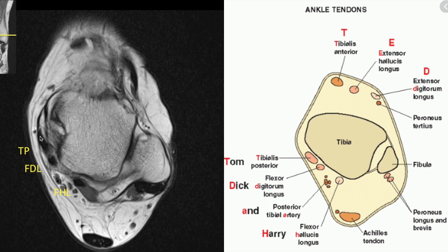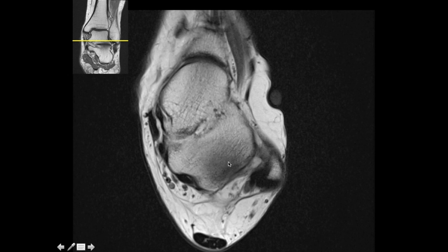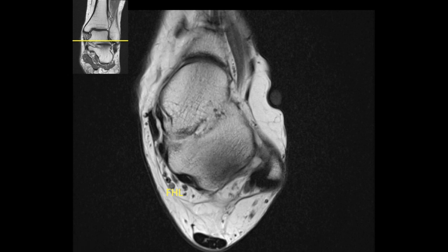Remember, the tibialis posterior is nearly double the size of the other two tendons. Going inferiorly, this is the tarsal tunnel which consists of the posterior neurovascular bundle. There is an osseous prominence along the posterior aspect of the talus — the posterior talar process — which forms a groove within which the flexor hallucis longus tendon sits. Sometimes large posterior talar osteophytes or an os trigonum can cause impingement on this tendon, resulting in posterior impingement syndrome.